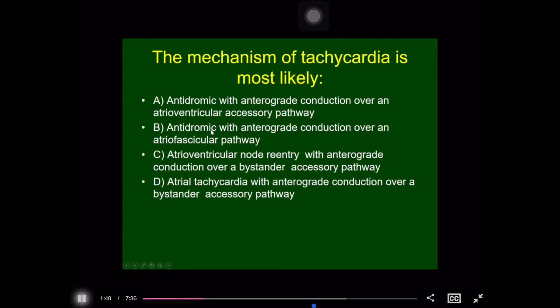B is antidromic tachycardia with anterograde conduction over an atriofascicular pathway. The third choice is atrioventricular node reentry with anterograde conduction over what we call a bystander accessory pathway. And the fourth choice is an atrial tachycardia with anterograde conduction over a bystander accessory pathway.